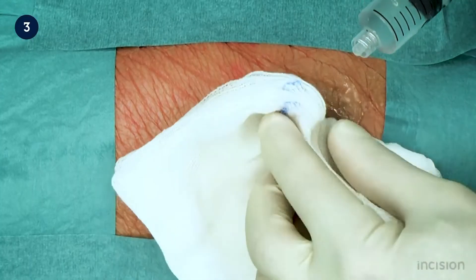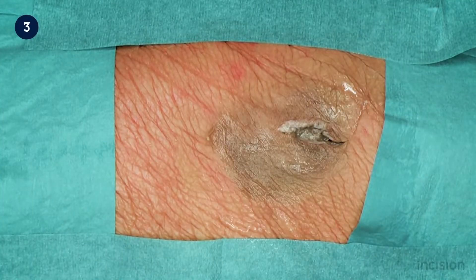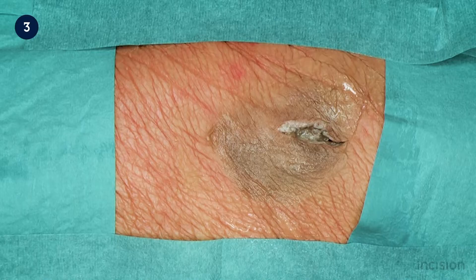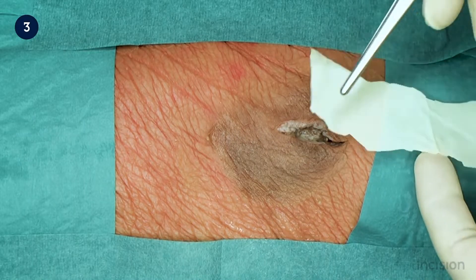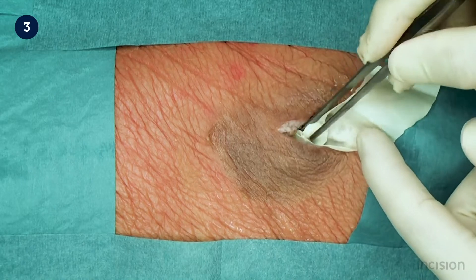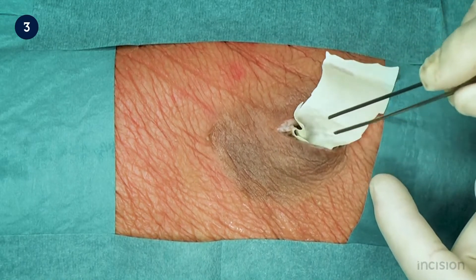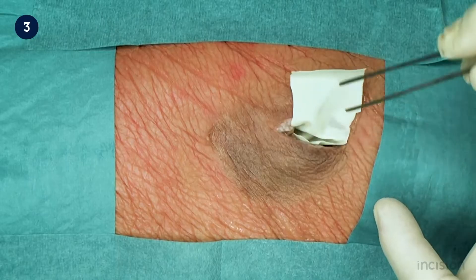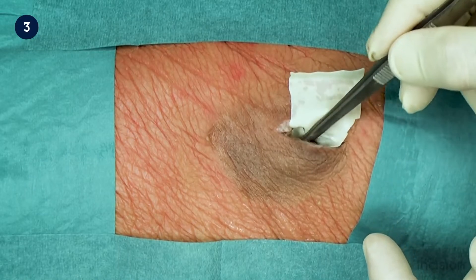If indicated, placement of a drain can be considered to ensure continued drainage and prevent early closure of the wound. If indicated, the irrigated cavity can be packed with a suitable material to prevent the wound margins from closing prematurely and to afford continued drainage.